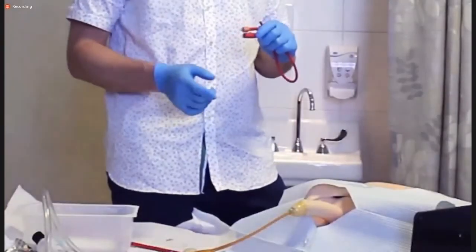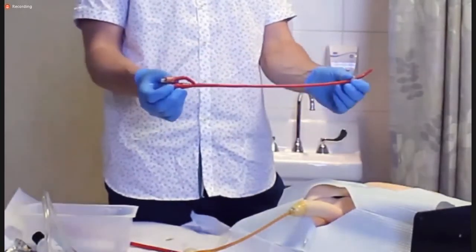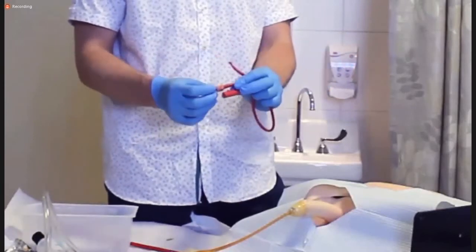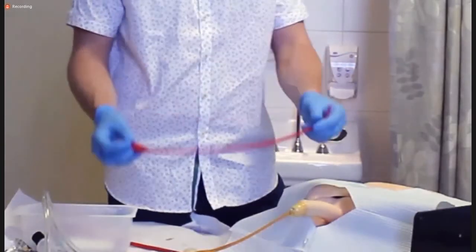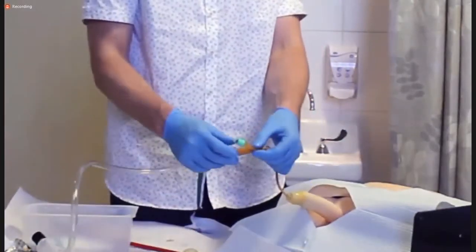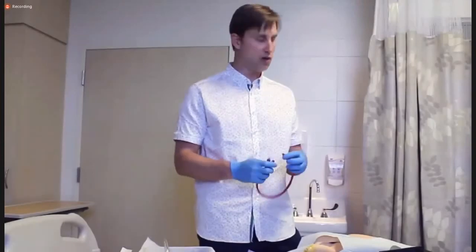So if somebody you suspect has prostate enlargement, you can try a coude tip catheter to negotiate through the prostate with the tip pointed up. And in some cases, it may be very helpful to use a larger catheter because a big prostate may require a little bit more pressure to negotiate the catheter through those large lobes. If your catheter doesn't go very far in before you hit a blockage, you may want to use a very small catheter like a 14 French. In other cases, if there's a bit of bleeding from the catheter being removed forcibly, placing another catheter is usually no big deal.